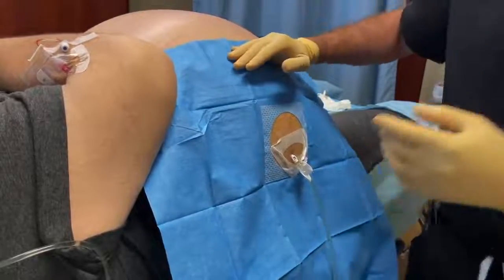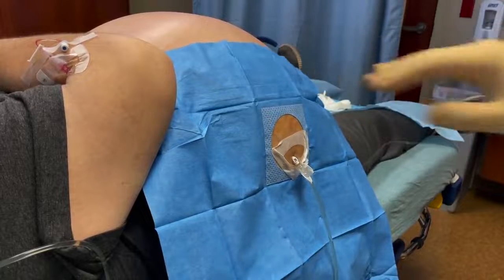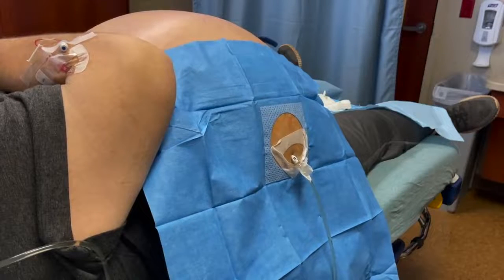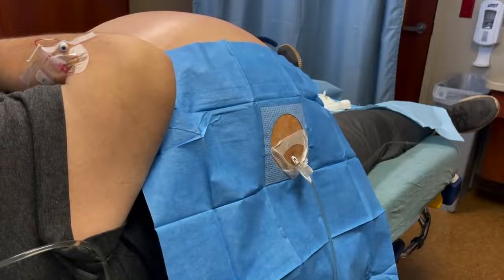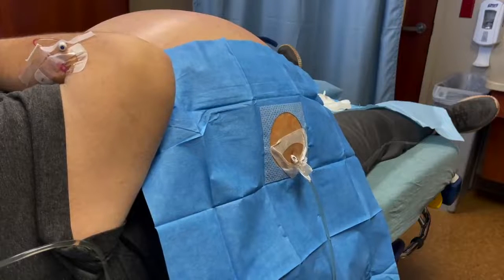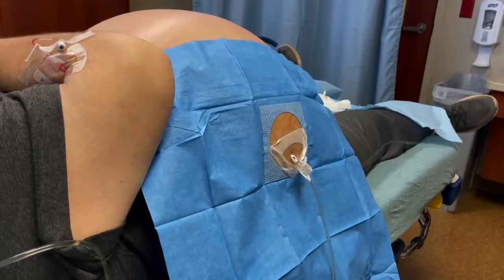We'll see how his belly is gonna change and come down as time goes on. Prior to changing the canister, I'd turn the suction off and then clamp it. Off and clamp it, yeah, and then change.